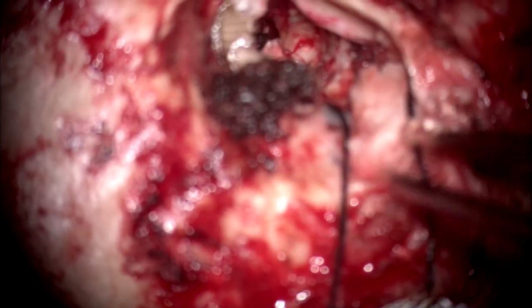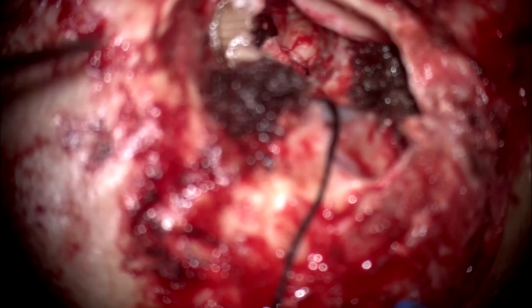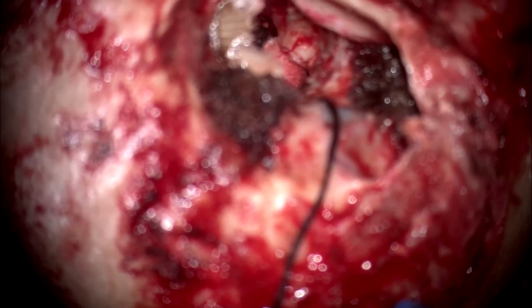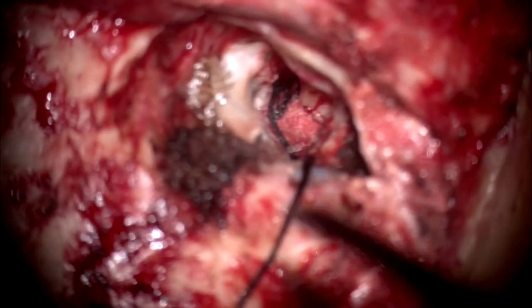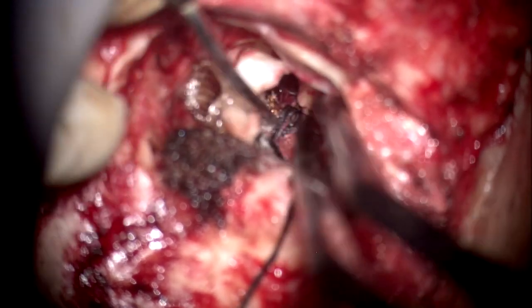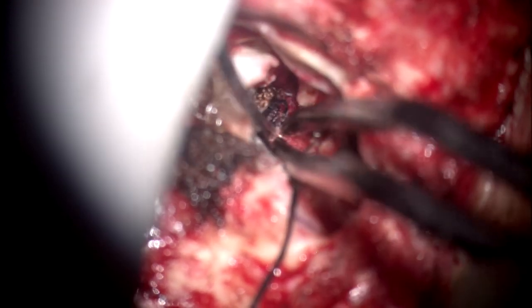The doctors, the faculties and the delegates out here are wanting to know, was there a scope of any endoscopic visualization of the bleeding point in this situation? You can try. No harm in doing that. But since this can be controlled like this with a surgical, you know.